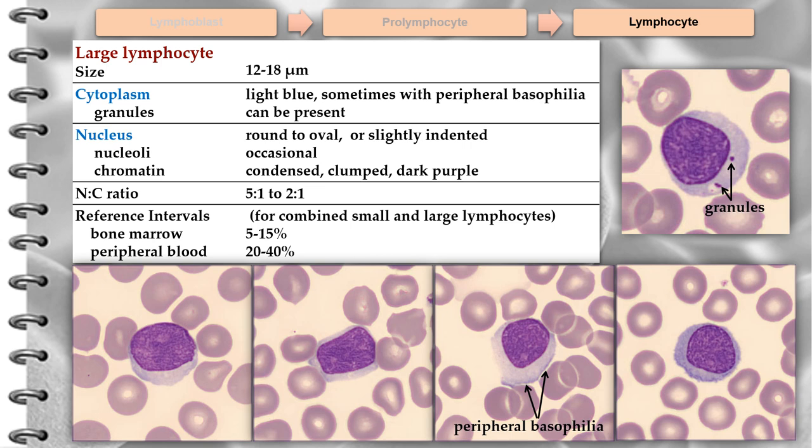Large lymphocytes are heterogeneous and range in size from 12 to 18 micrometers in diameter. The cytoplasm can be lighter blue with peripheral basophilia, or darker than the cytoplasm of small lymphocytes. Azurophilic granules can be present; if prominent, the cell is described as a large granular lymphocyte. These granules differ from those of the myelocytic cells in that they are peroxidase negative. The nucleus is round and can be slightly indented, and the nuclear chromatin can appear similar to that of the small lymphocyte or more dispersed.